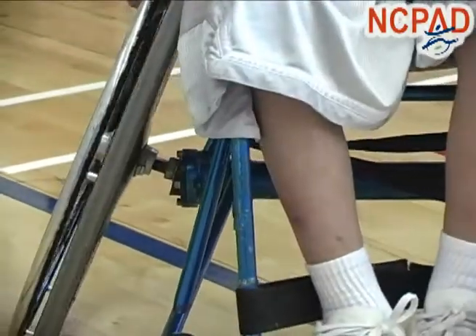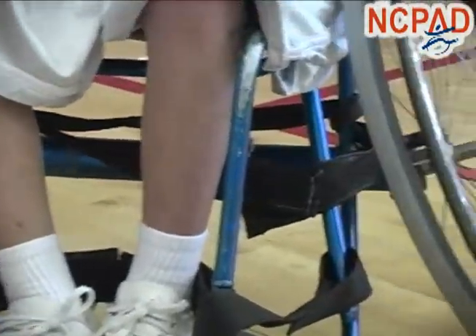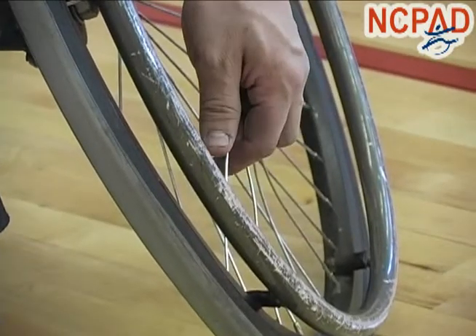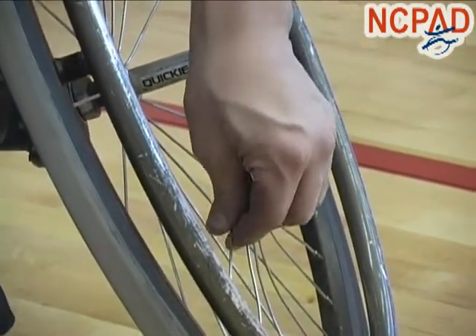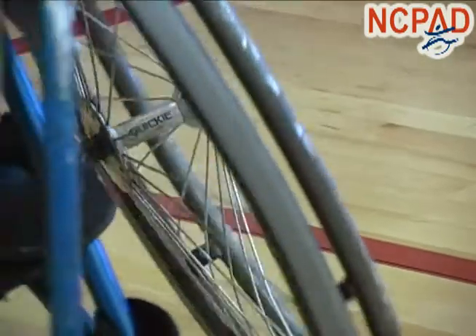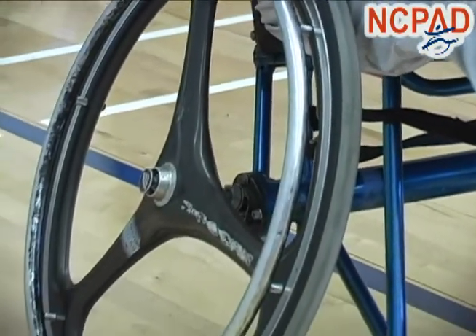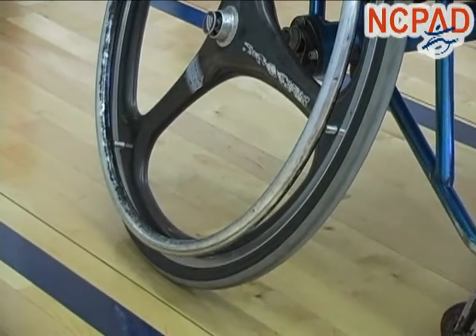But usually they're aluminum or they're alloy. The spokes are regular aluminum. Some actually are like a wire with a rubber coating. The rims are pretty much flimsy — at some point they will bend.